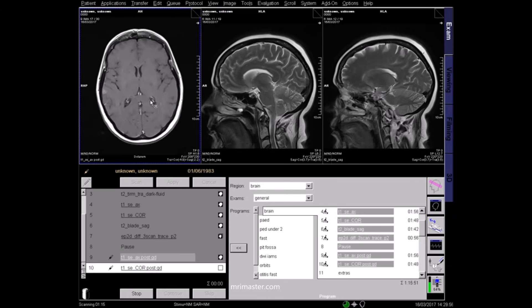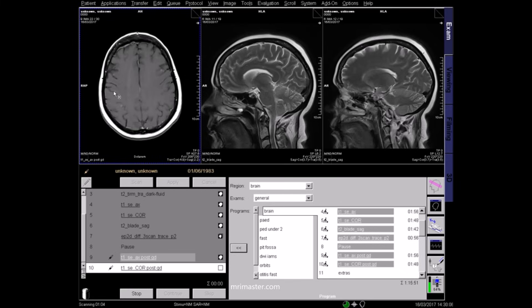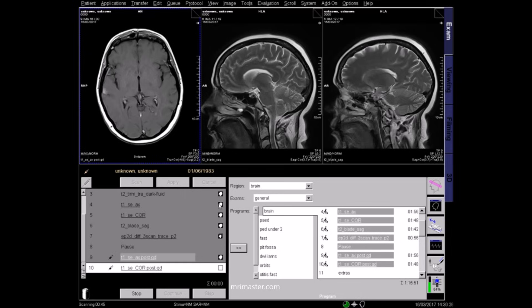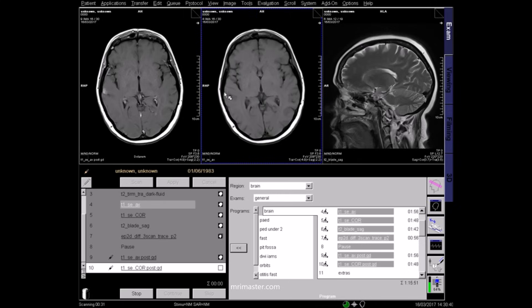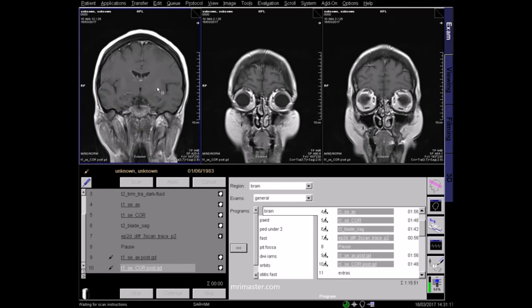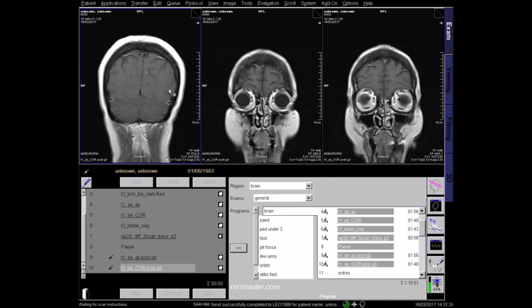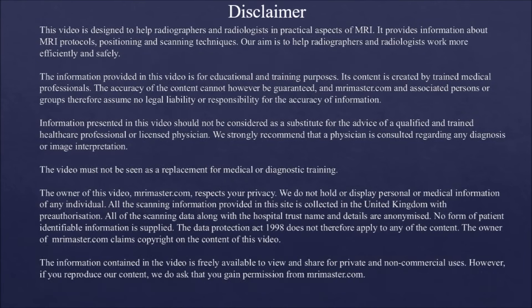This is a T1 post-contrast axial sequence. In this case, you can see multiple enhancing lesions, in comparison to the T1 non-contrast axial scan. On the T1 coronal sequence, the lesions are again visualised as bright areas.